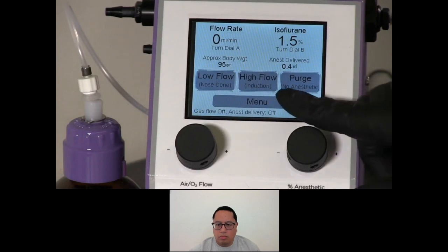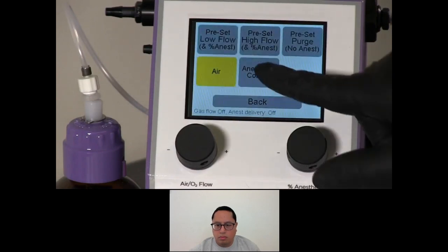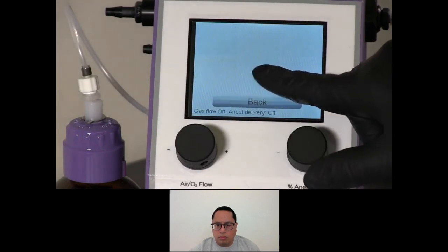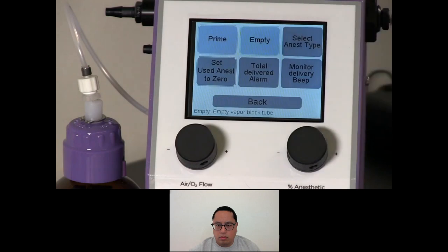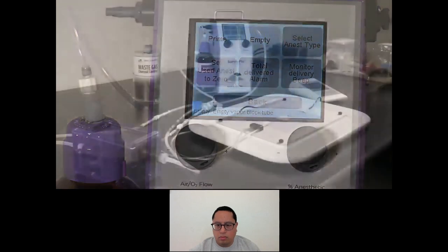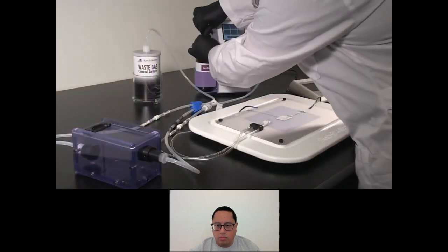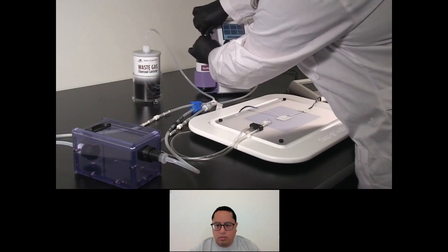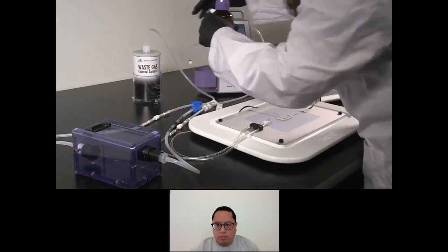When you're finished using the system for the day, touch Menu, Anesthetic Control, and Empty to empty the anesthetic from the SomnoFlow. Once complete, you may remove the anesthetic bottle from the system. Remove the bottle top adapter and replace the manufacturer's cap onto the anesthetic bottle.